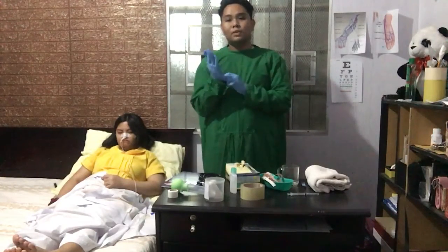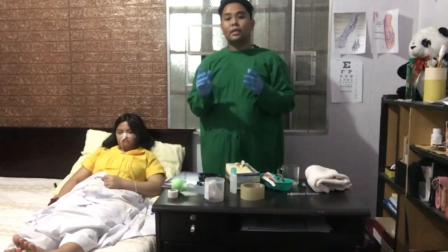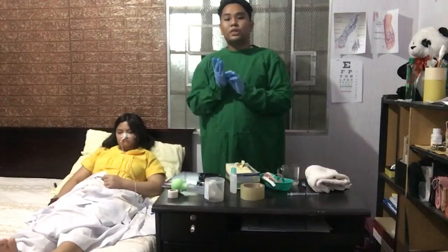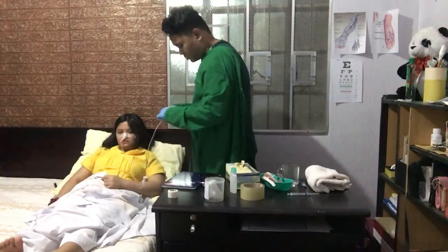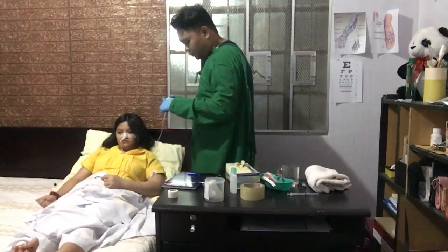Then, after multiple steps have been taken to ensure that the feeding tube is located in the stomach or small intestine, we aspirate all gastric contents with the syringe and measure to check for the residual amount of feeding in the stomach. Aspirate tayo.